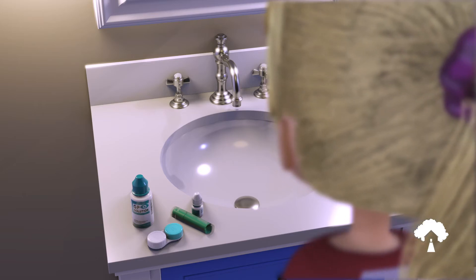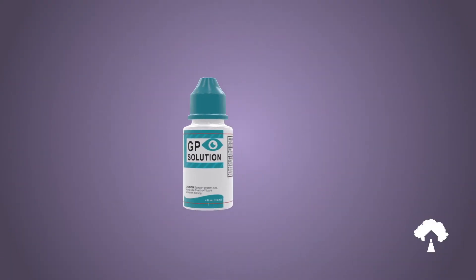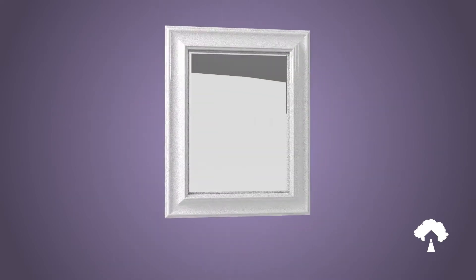Have all supplies ready before beginning the insertion process: your lenses, lens case, approved gas permeable care solutions, artificial tears, an insertion and removal device if using one, and a mirror.